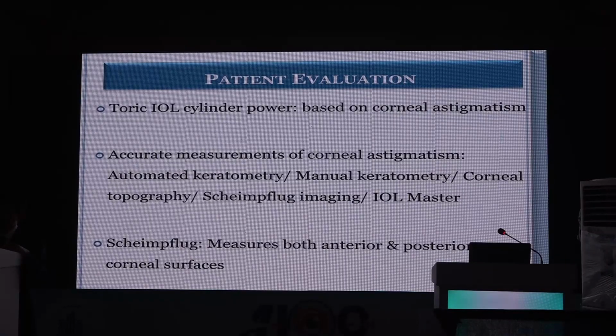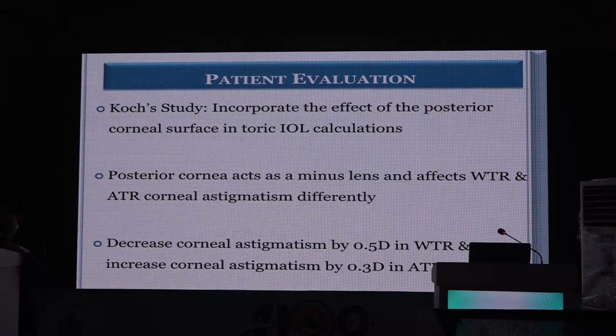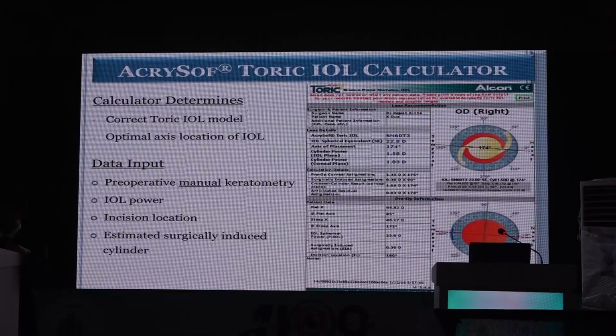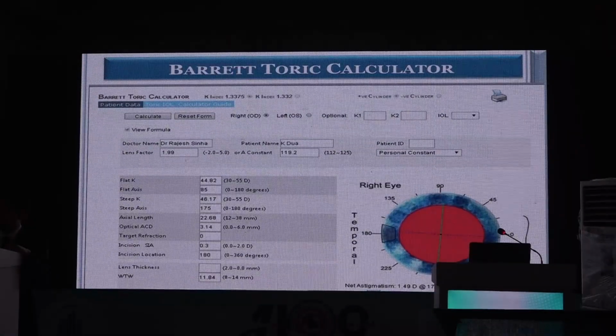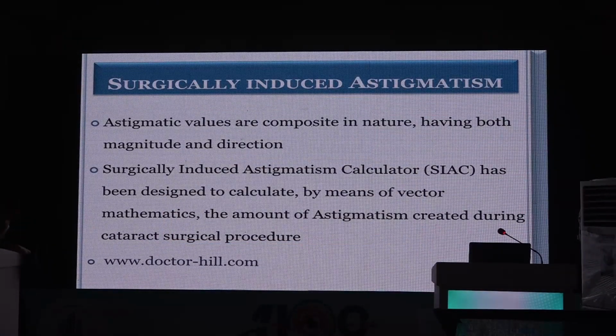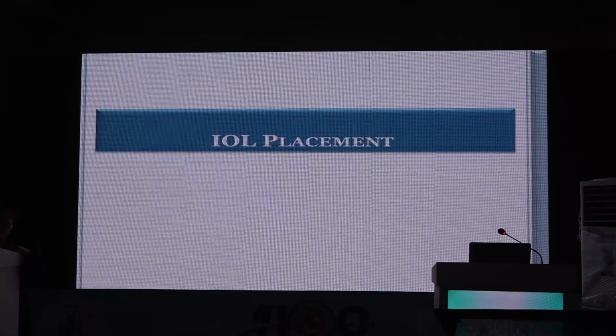And as I said, Toric IOL cylindrical power is based on corneal astigmatism. Imaging is done for patient evaluation. Dr. Vanashri has already covered all these IOL power calculations, so I'll just skip that and move on. I'm sorry for that.